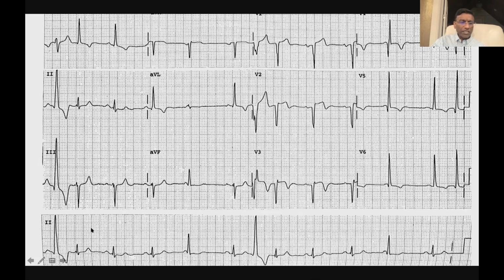If you measured in timing, the PVC should have fired exactly here. But once it comes out of its little cellular zone that it's firing out of, what is it going to find? It's going to find that the ventricle is refractory. It's already all done. And you remember what refractory period is. What's a good way to conceptualize refractory period? No more complicated than a flush tank.